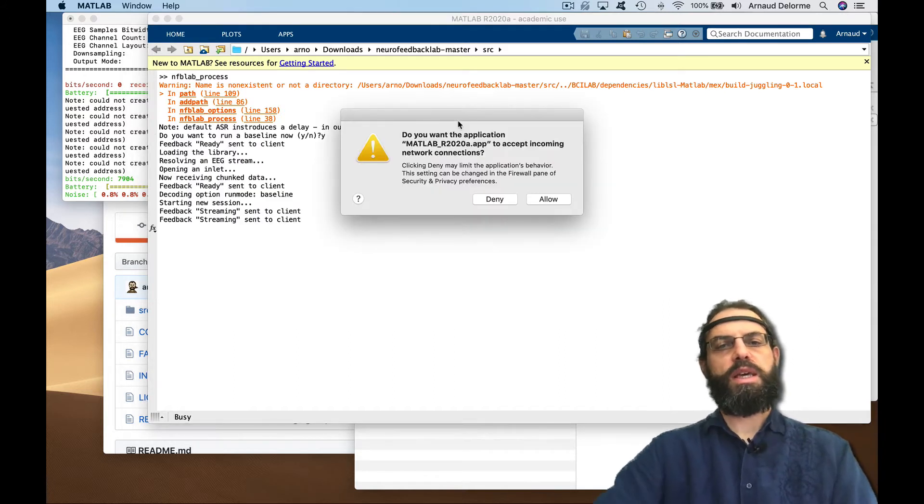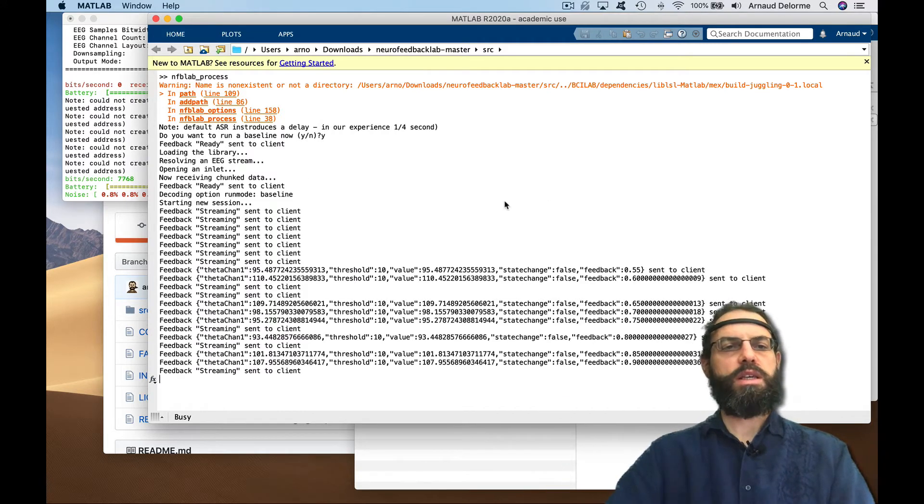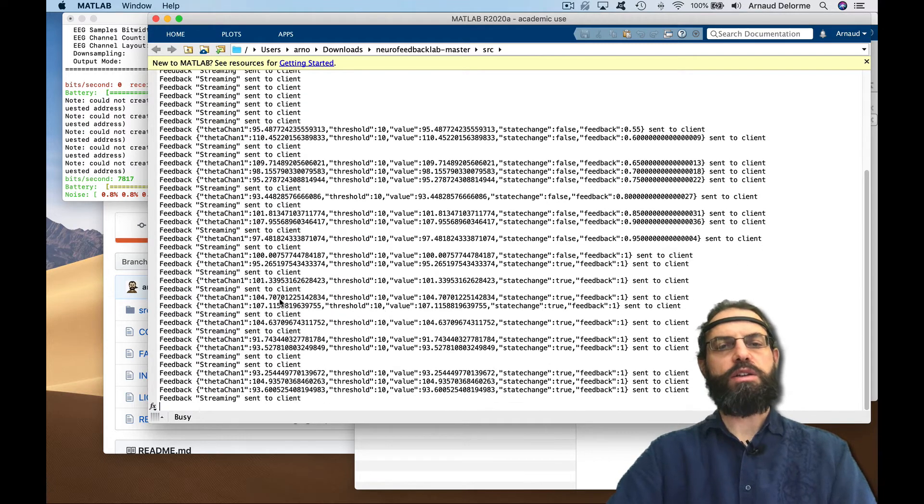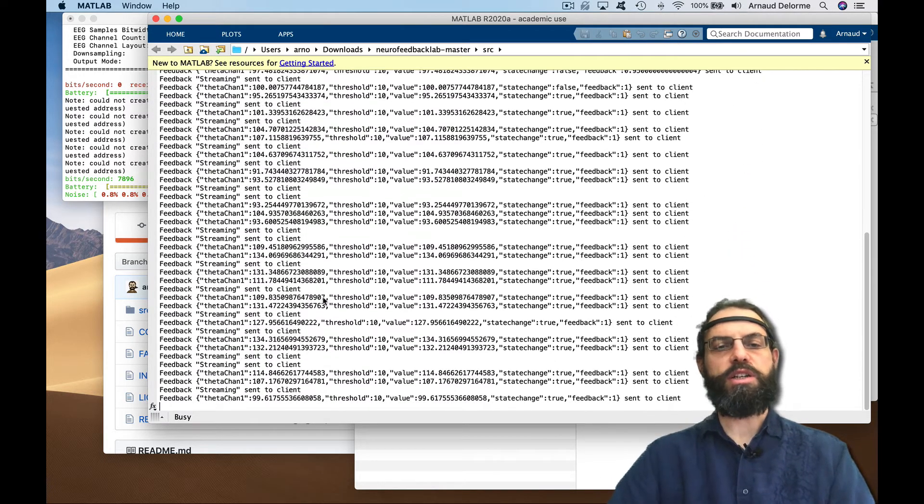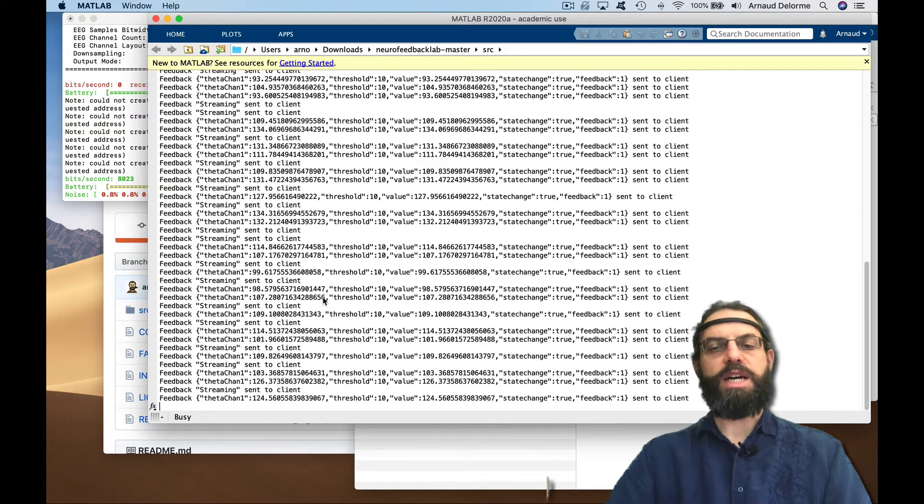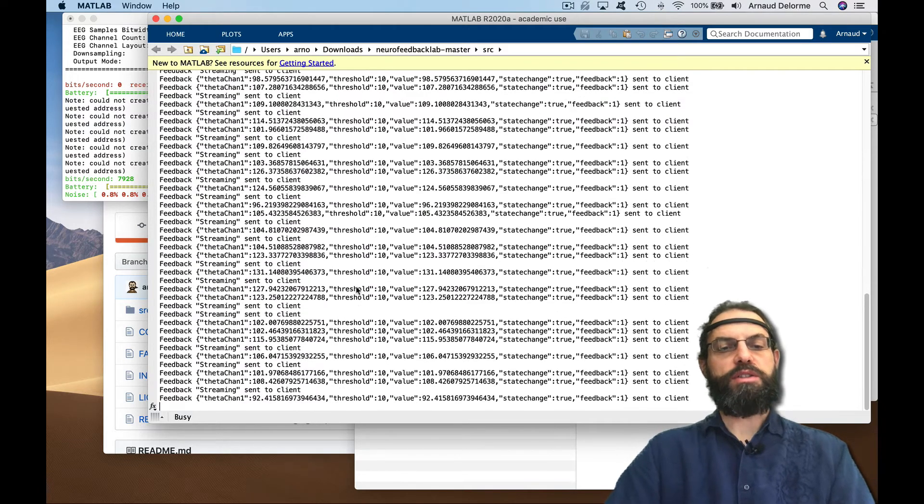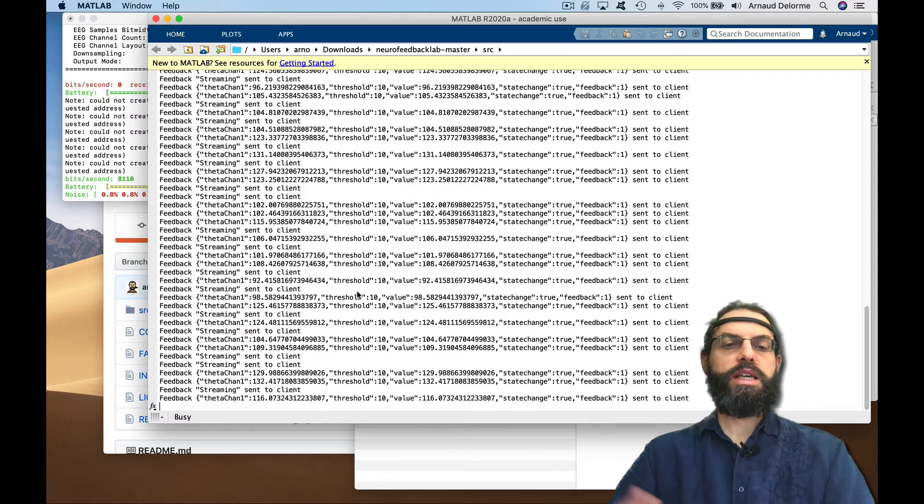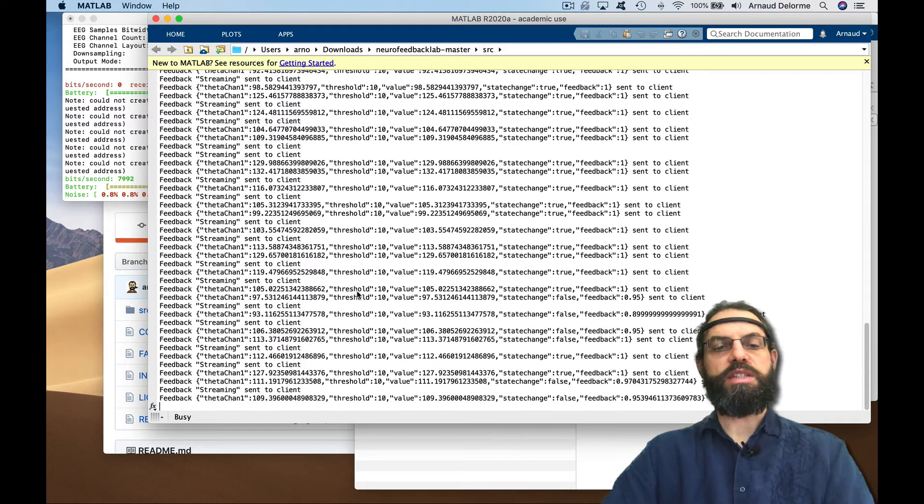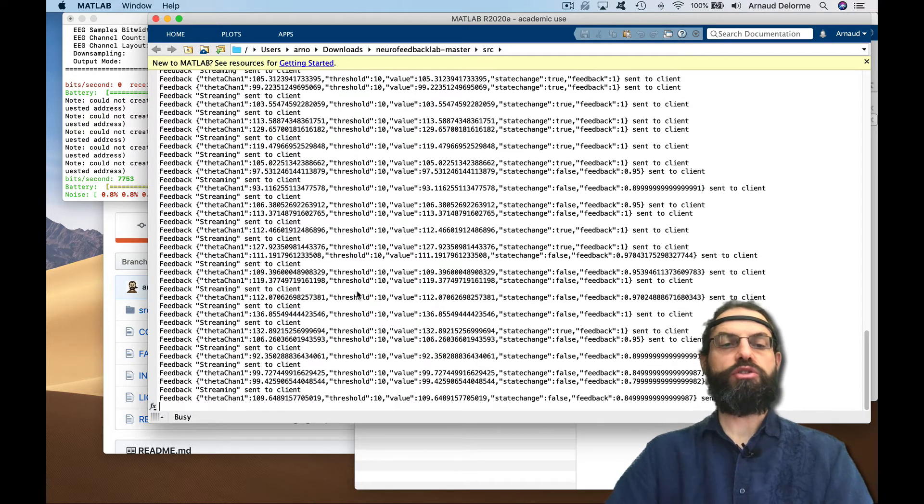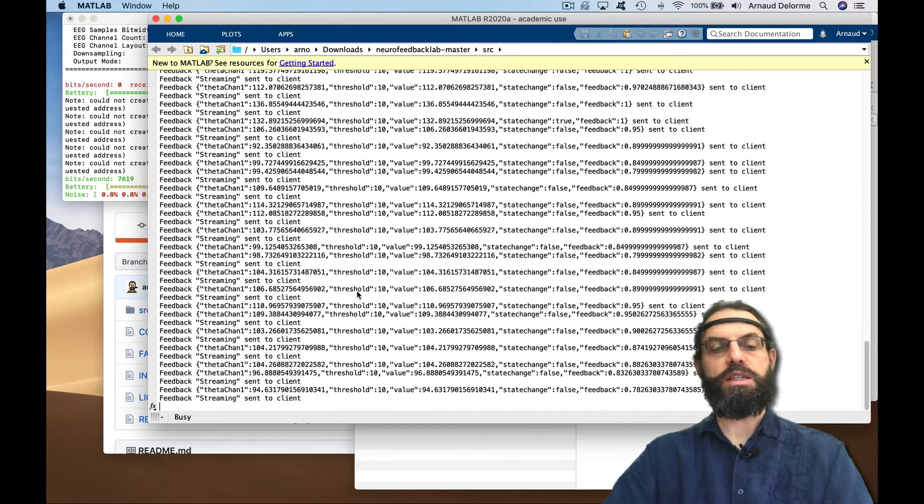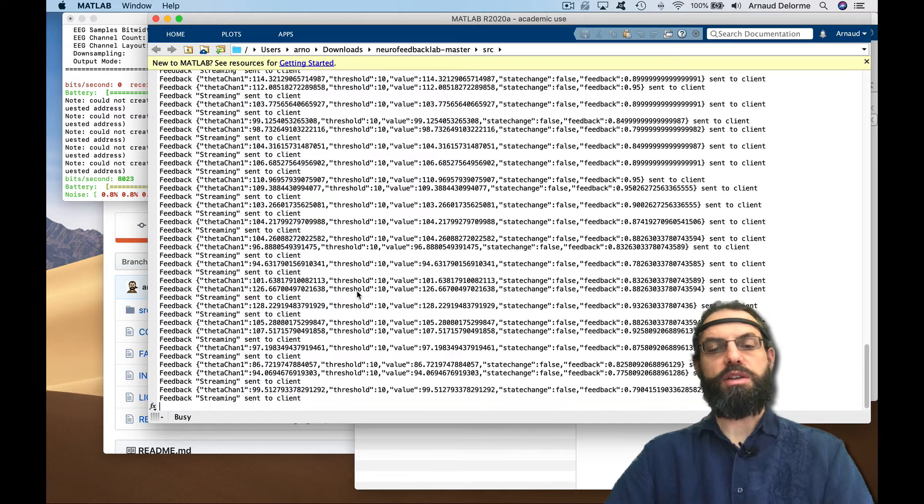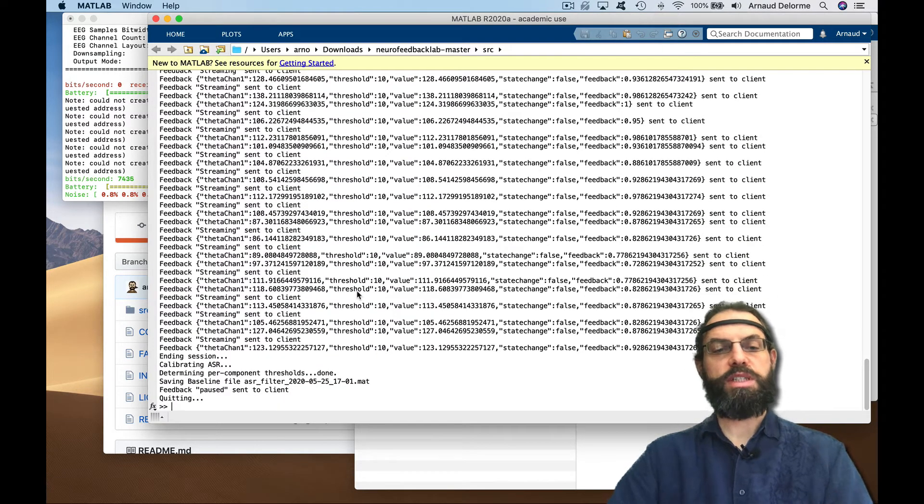I'm going to press yes and now it's streaming, connected to the Muse, putting out all this text. In another video I'm going to go into detail about what this text is, the type of feedback that would be returned. As soon as it's done, it's going to stop and save a data file. It takes about one minute. Usually you don't want the subject or participant to move when this is happening; you want them to stay still so you can collect clean data.